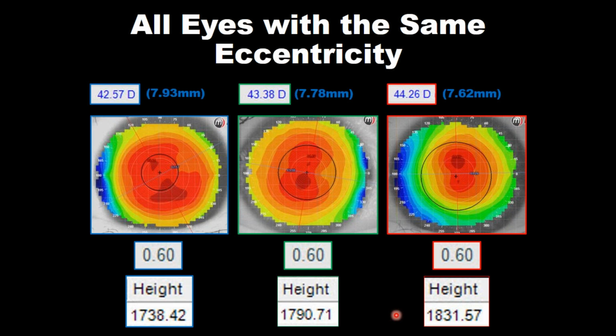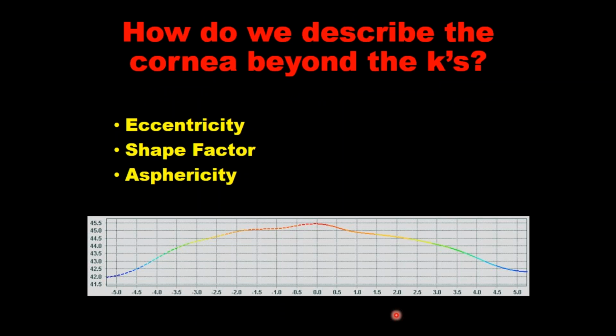So what? What's 50 something and 40 microns? Well, in an Ortho-k lens, you're targeting 5 to 10 microns central thickness. So 40 or 50 microns is a humongous amount of error in the construction of our lenses. So the K reading is a very important value in the overall determination of your initial lens.